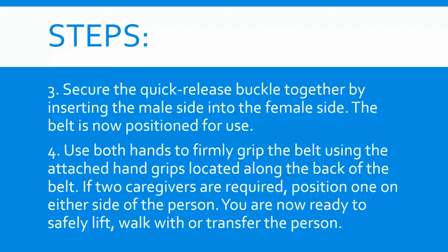Use both hands to firmly grip the belt using the attached hand grips located along the back of the belt. If 2 caregivers are required, position one on either side of the person. You are now ready to safely lift, walk with, or transfer the person.